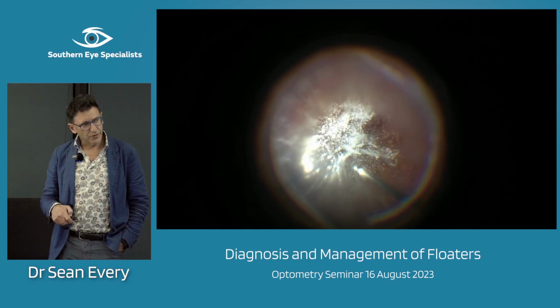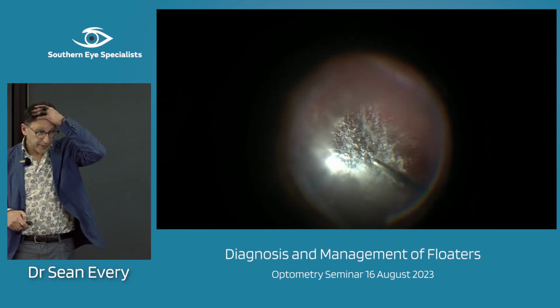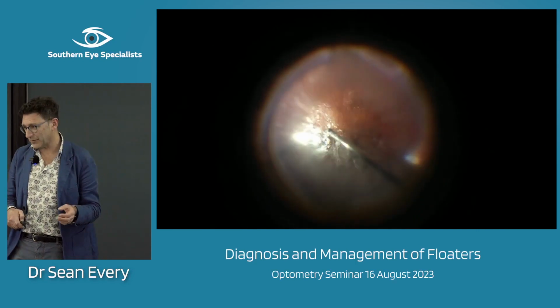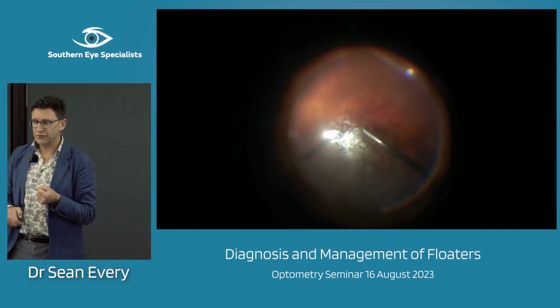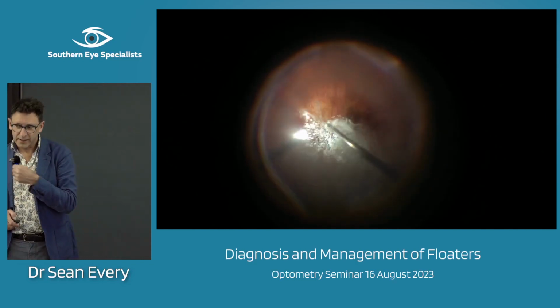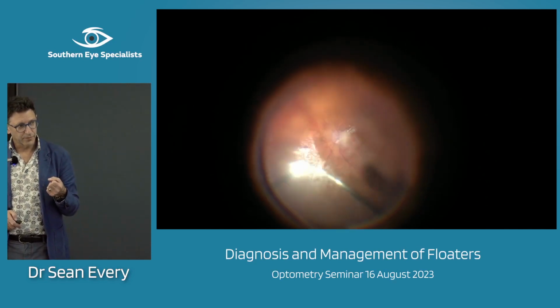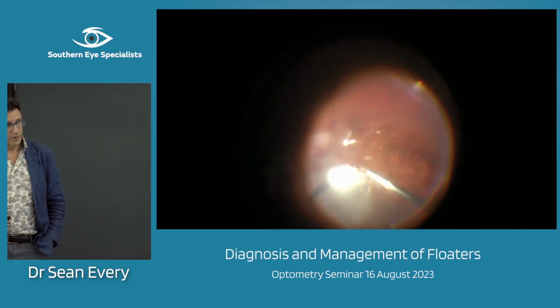But this is just removing it, but the thing about the people with asteroid is that they generally haven't had a posterior vitreous detachment. And so, as I said, when you surgically induce that, that is the time when as a surgeon, you can't control the forces that are going. This is just real time actually, but pretty.